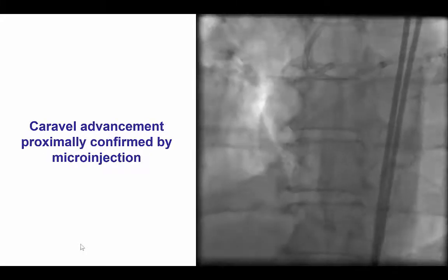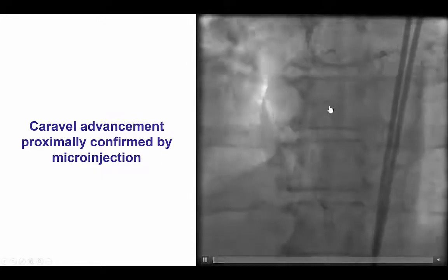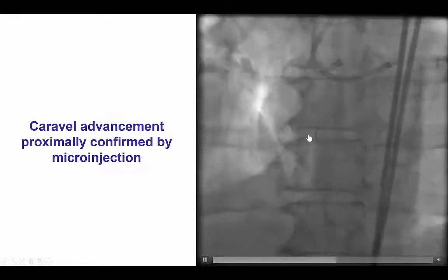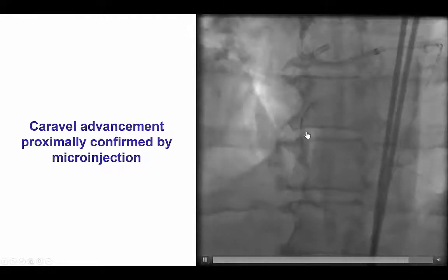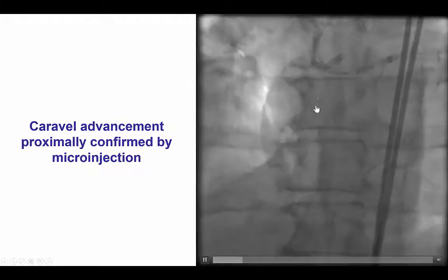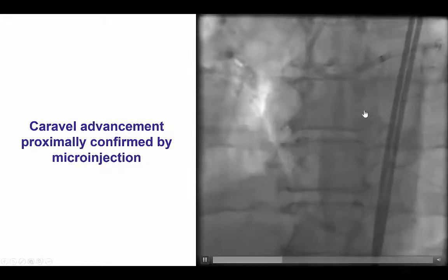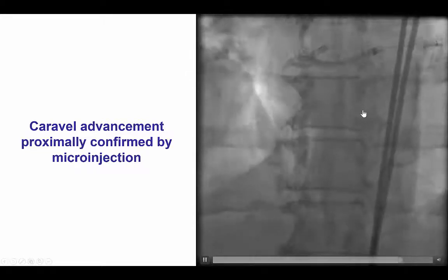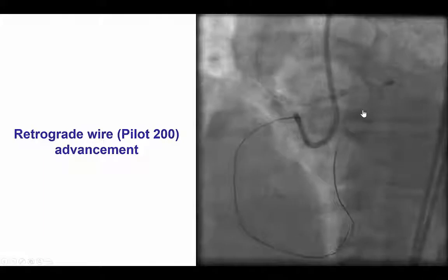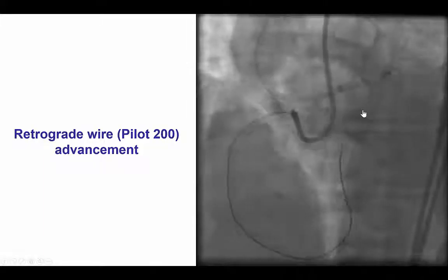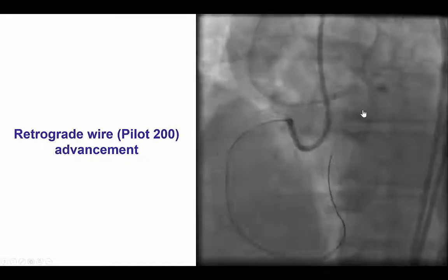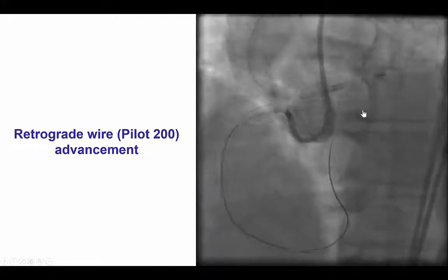We were able to advance to the proximal, where we had difficulty advancing further, likely because of the previously placed stent. We did a micro-injection, the so-called CARLINO technique, to confirm that we were in the right space, and to help modify the plaque and help us advance a little bit further into the proximal right coronary artery. Eventually we were able to advance the CARAVAL microcatheter over a PILOT 200 all the way to the right coronary ostium in the subintimal position.